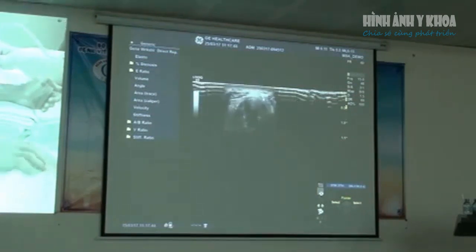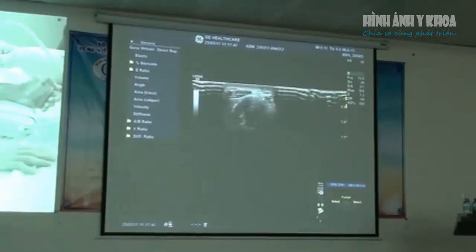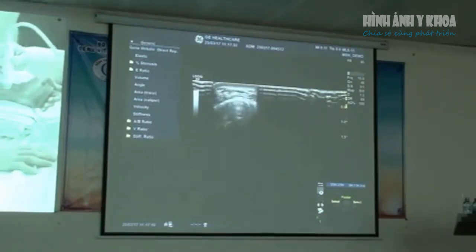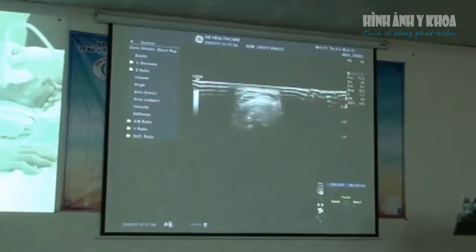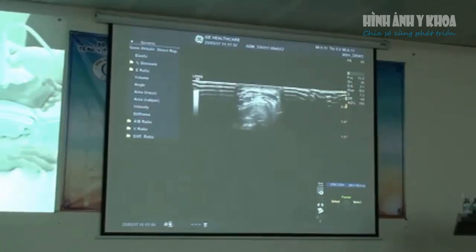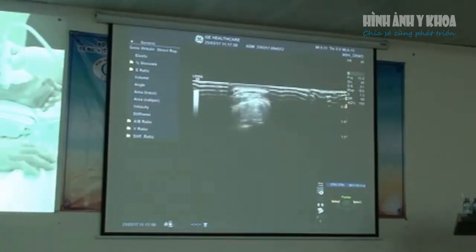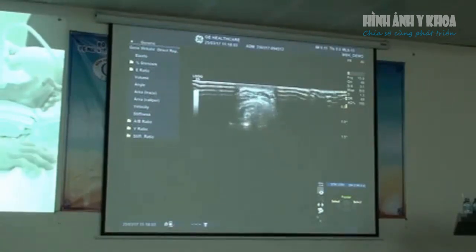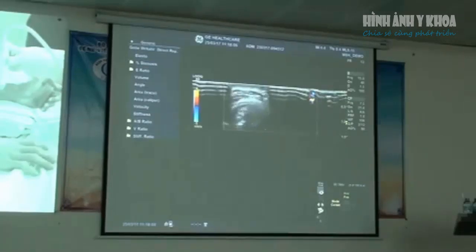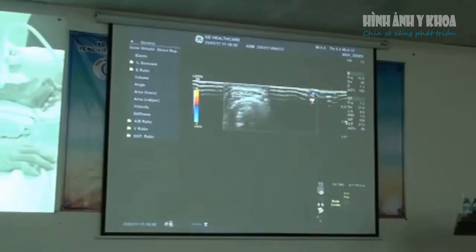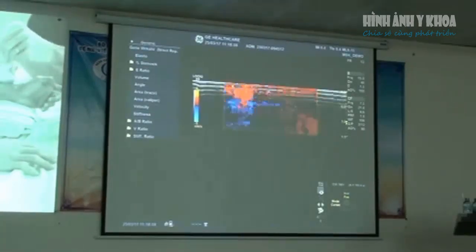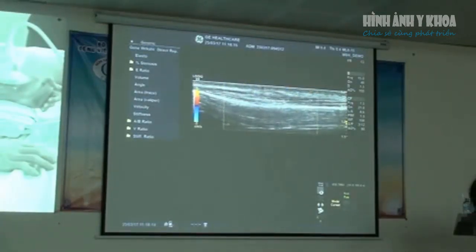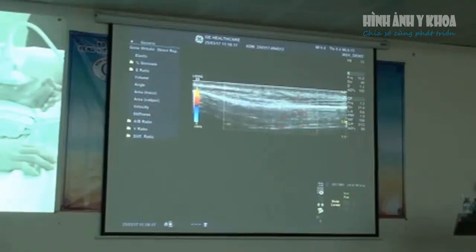You can see here, this is up a little bit higher on the wrist. As I come down, see where those two tendons meet and go over the top of each other. That's a very common site for proximal intersection syndrome. We also use color and look at it in two planes just to make sure there's no sheath fluid or anything there.